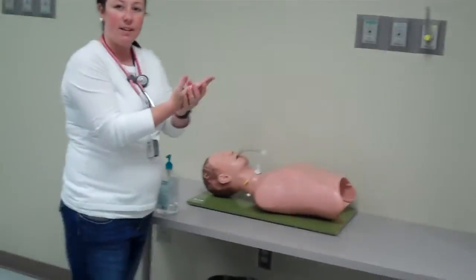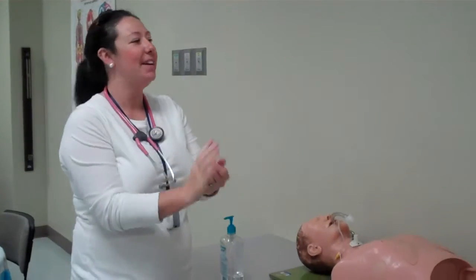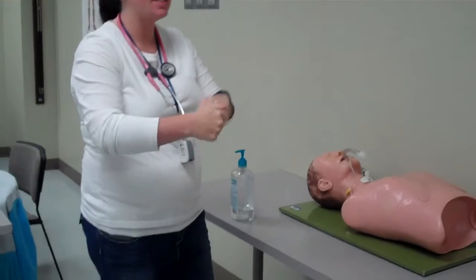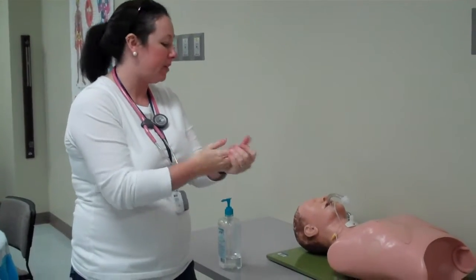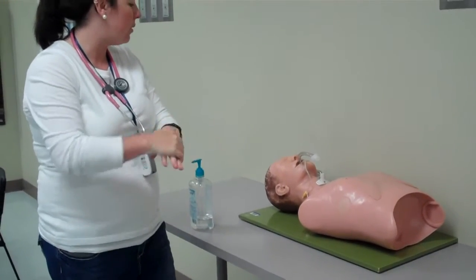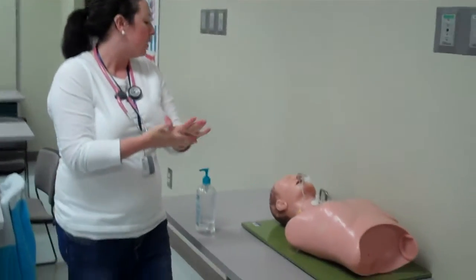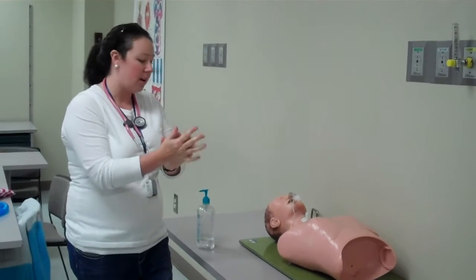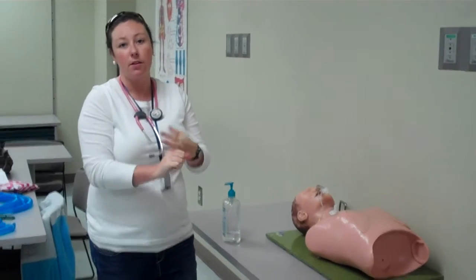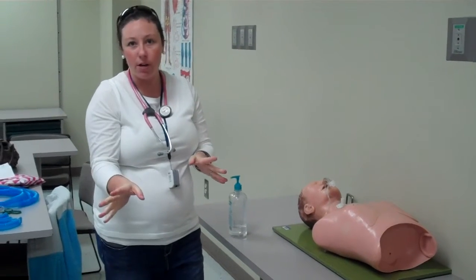Hi Ashley. This is my brother, Bill Trake. Hi Mr. Bill Trake, how are you today? Yeah, you can't speak very much with that tube in your mouth. The doctor is wanting to get you off of that, so we're going to do what they call a T-bar trial. I'm going to hook you up. Since your brother's in the room, I'm going to be explaining this to both of you. Anytime you have someone who's on oxygen, oxygen supports combustion so we can't have any smoking. There are no lotions unless you get them from the nurse — if you need some, just let them know and they'll get you whatever you need.